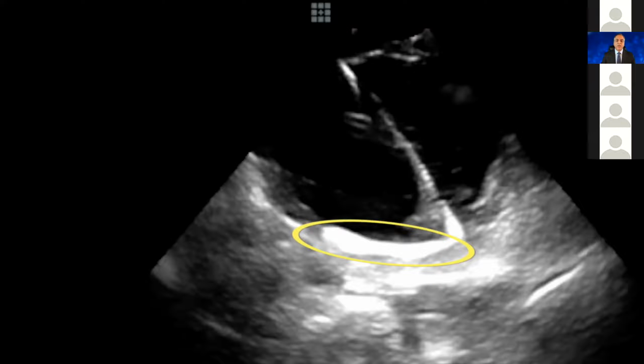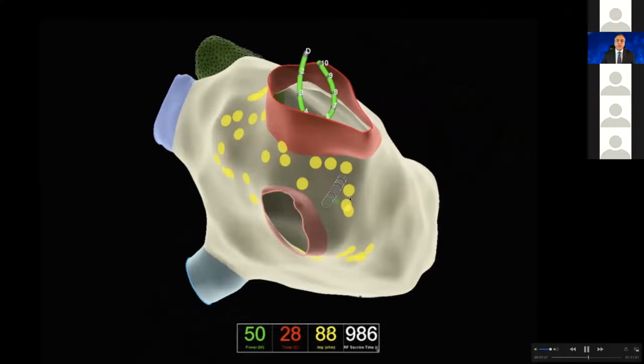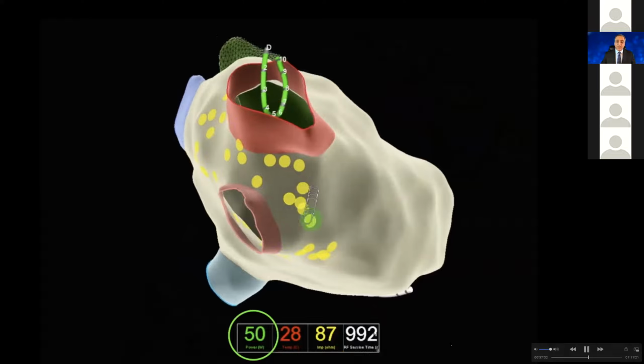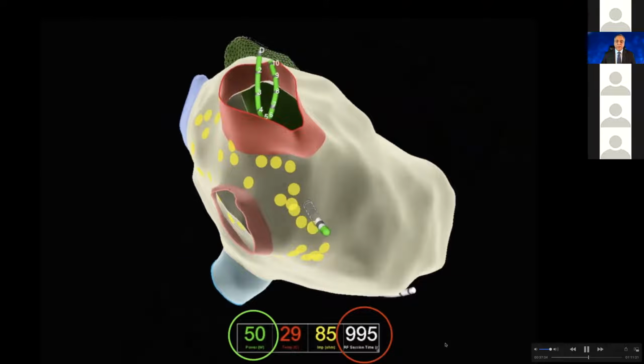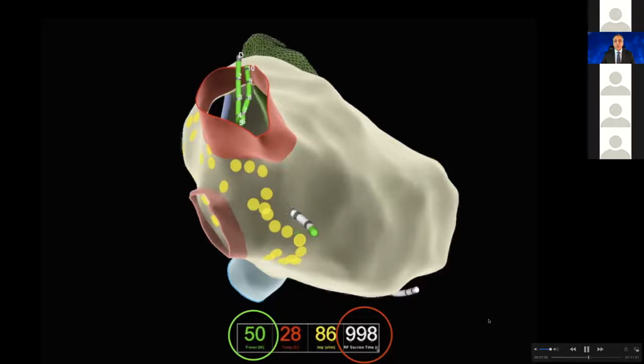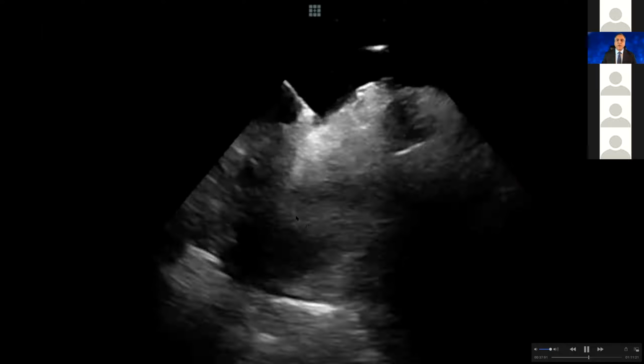This was the anterior part of the right inferior pulmonary vein. And here, we are in the right inferior pulmonary vein, anterior part of it. And you can appreciate it here. Really, sometimes I tell my techs, why did you stop burning? They say, oh, we didn't. It timed out. You can see that sometimes you can do all the veins with a single burn from the beginning to the end. Sometimes it really stops. And we have done perhaps all 4 veins with 1 burn.